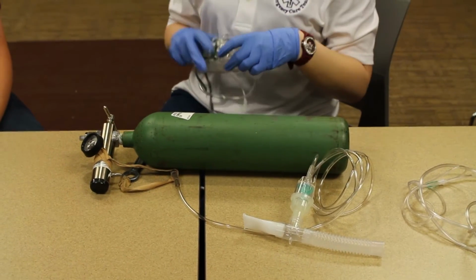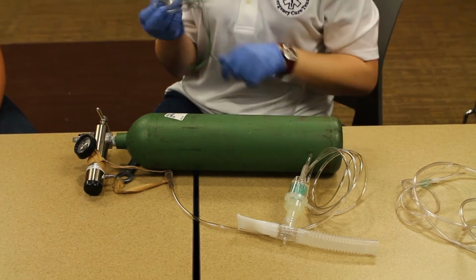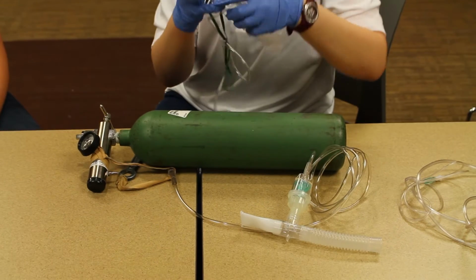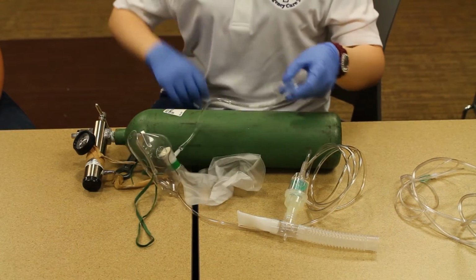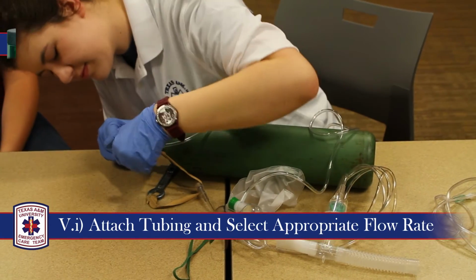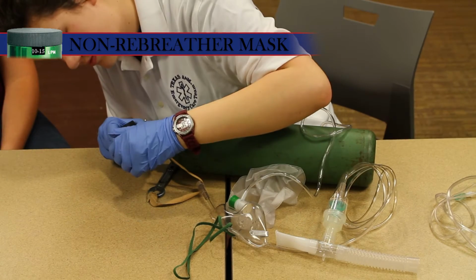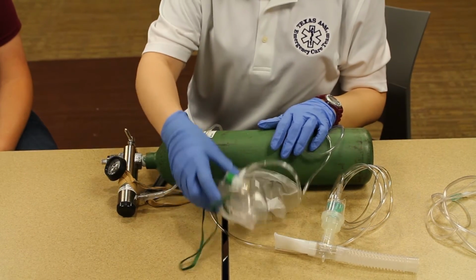Finally, we will take a look at the last oxygen administration method, which is via non-rebreather mask. This method is used to apply high-flow oxygen to a conscious patient. Begin by attaching the tubing to the regulator and setting the appropriate flow rate, which for a non-rebreather is 10 to 15 liters per minute.